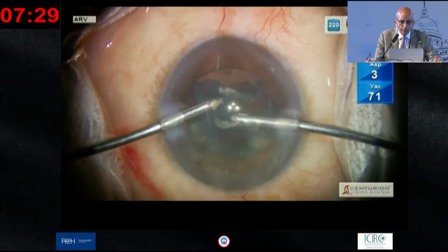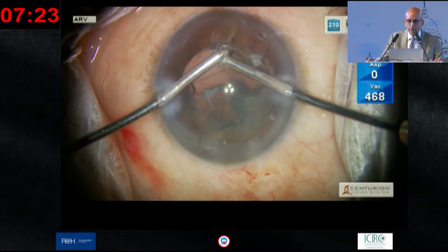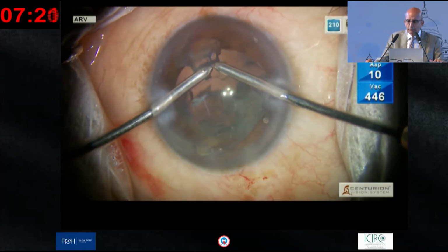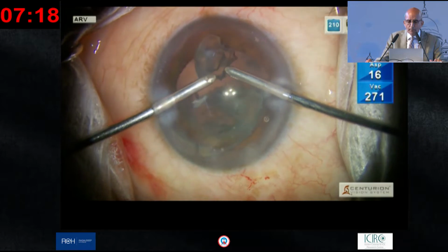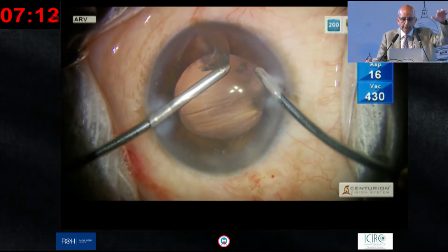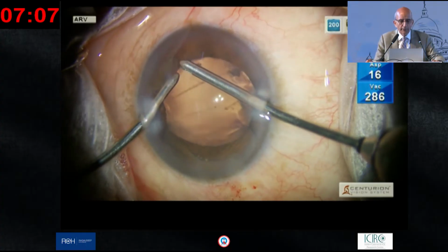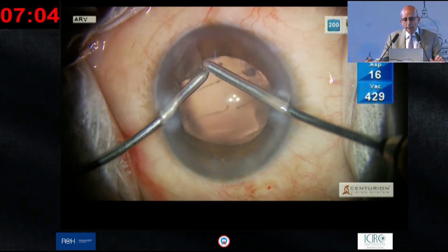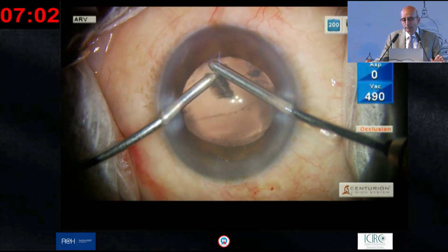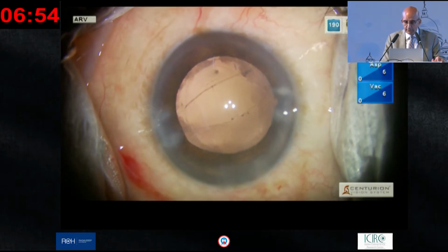And now I'm putting irrigation behind that epinucleus and trying to remove that with a very gentle aspiration flow rate, 16 cc. My IOP has gone up now to 50 to make sure that the fluid is pressurizing the open capsule. So far, we have not disturbed the vitreous, and it seems that we are fortunate, and we did prevent what we wanted to, vitreous prolapsing. And now we need to make sure that we fixate the IOL at the right time, right place.